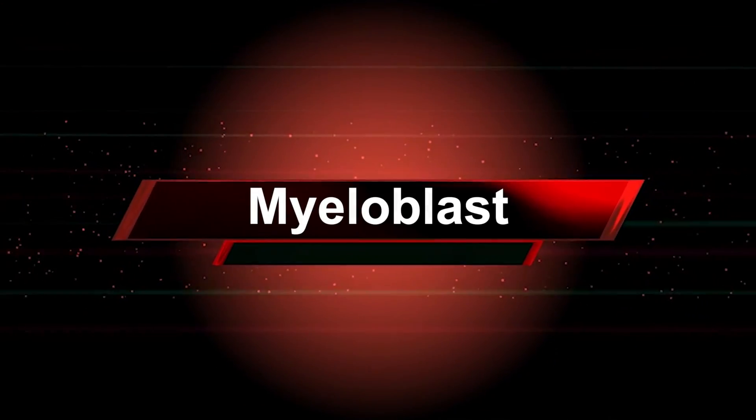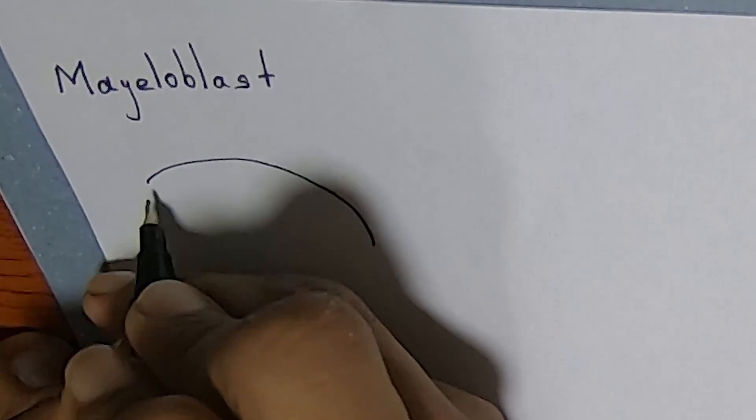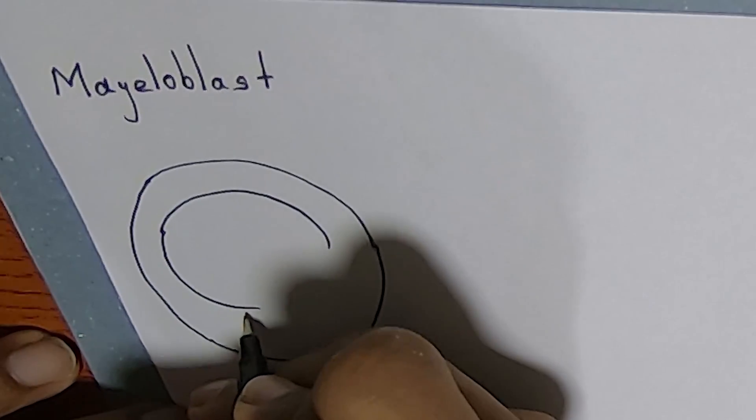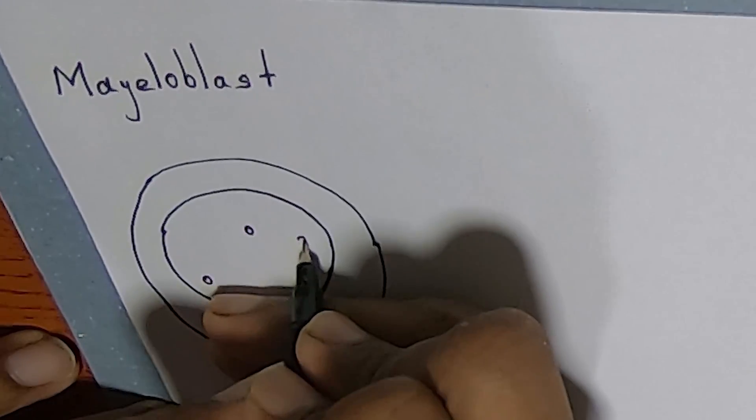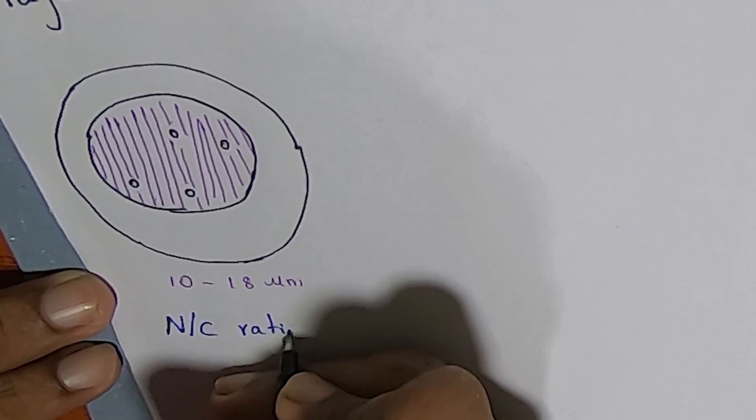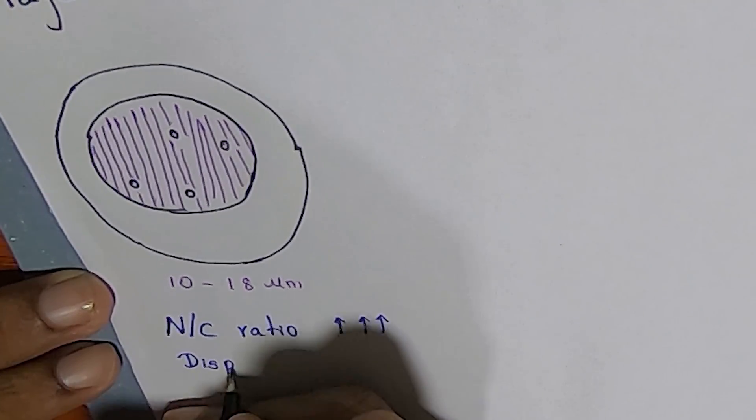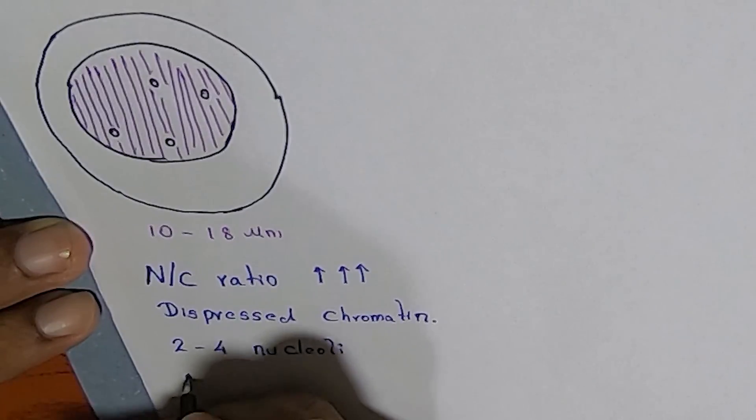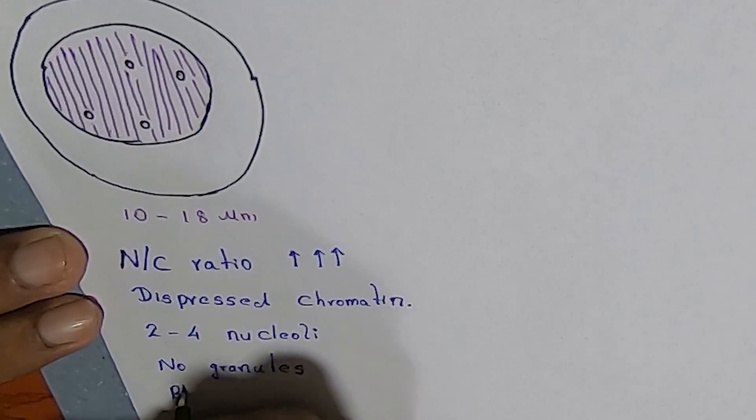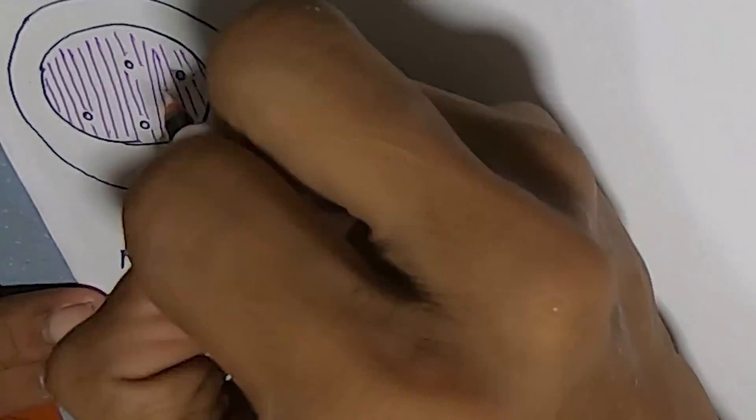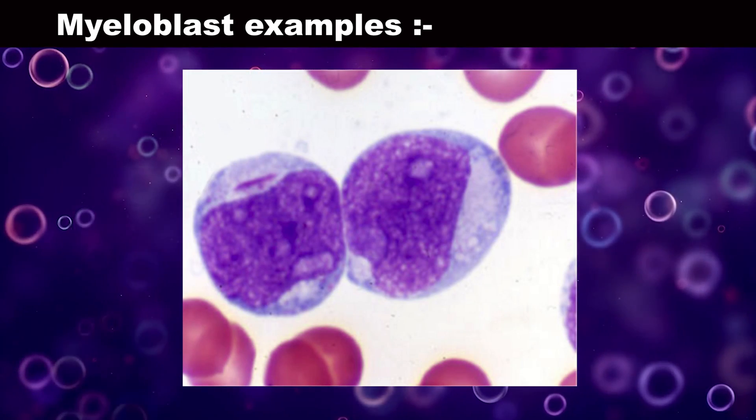Myeloblast: the first committed stem cell of granulocytes. In myeloblast, usually it is spherical and about 10 to 18 micrometers in size. Nuclear to cytoplasm ratio is very high. It is evenly dispersed chromatin with two to four nucleoli, and it does not contain granules. However, cytoplasm is blue in color due to high RNA content. These are some real examples.